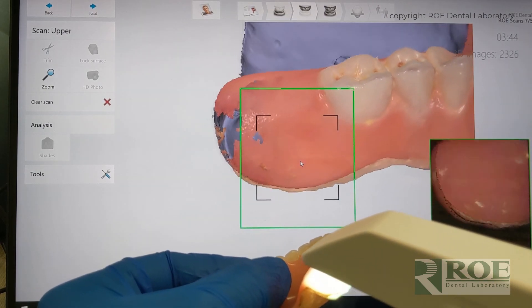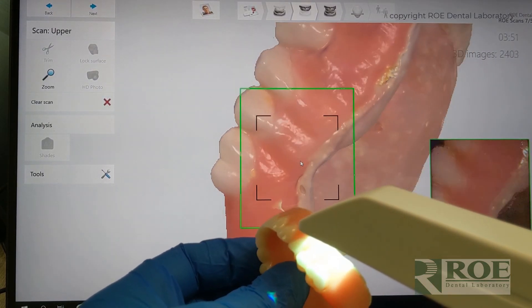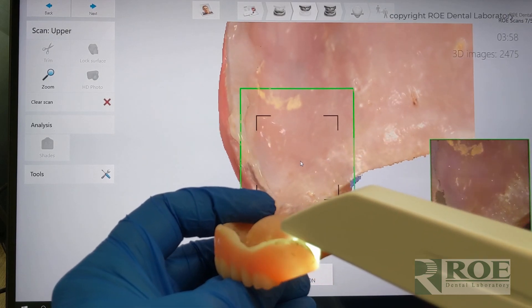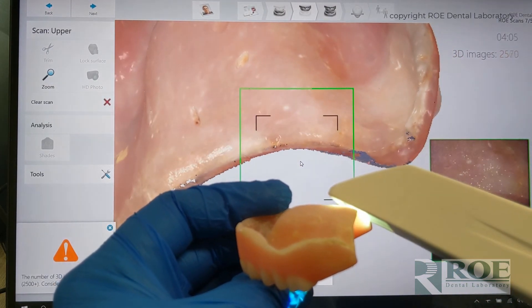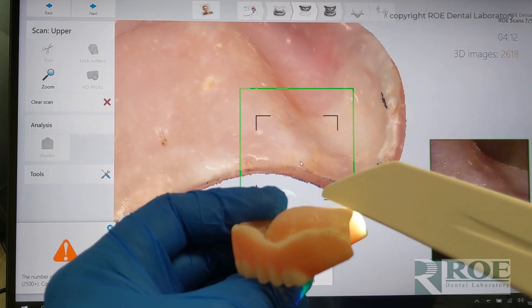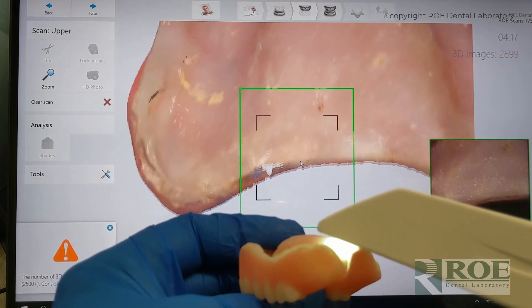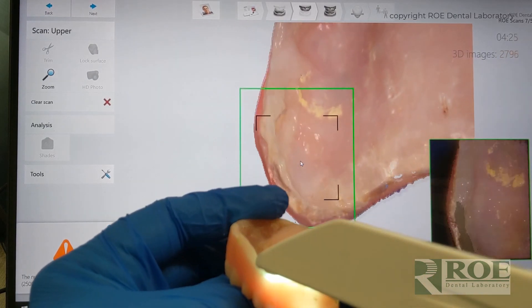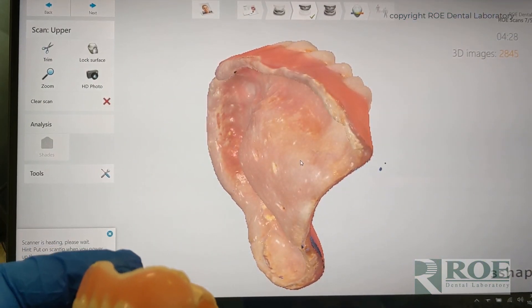You can see where it struggles with shiny areas — you really want to get this. There, that got it perfectly. The other critical area is we want to make sure we get the full distal extension. I'm getting a little pop-up about too many scans, so we want to wrap this up quickly. We want the distal extension so we can put a nice butterfly in there and really reproduce this denture. This scan can be for copying a denture exactly, or because we're going to scan the bite and the opposing, we can make a brand new denture with new teeth. Let's inspect this scan.